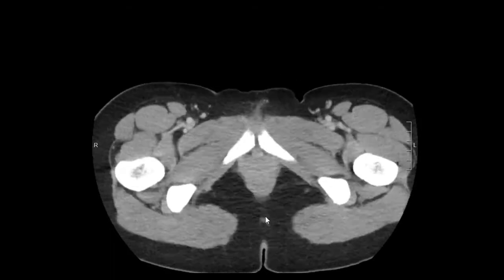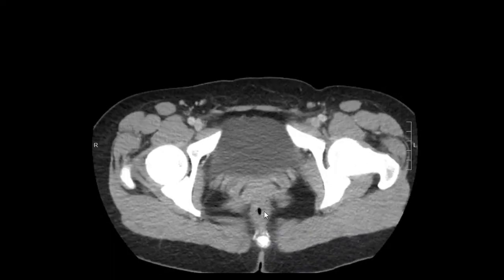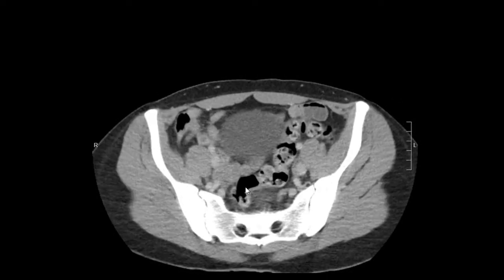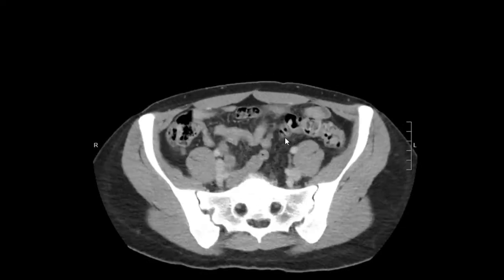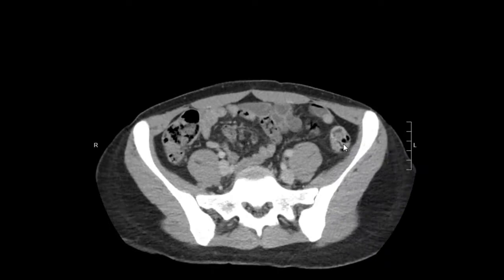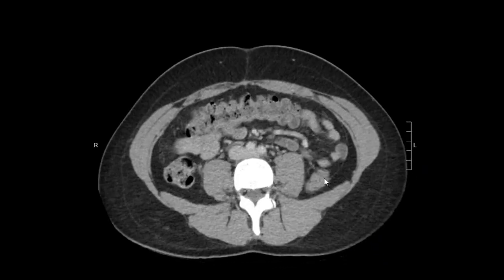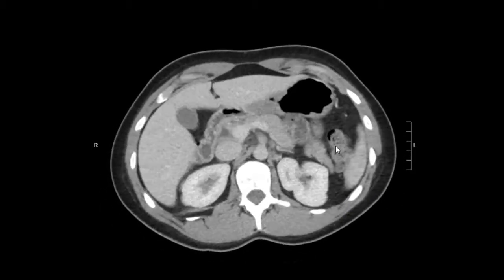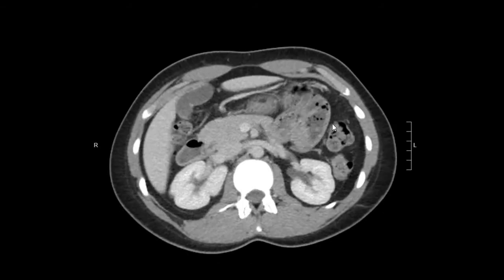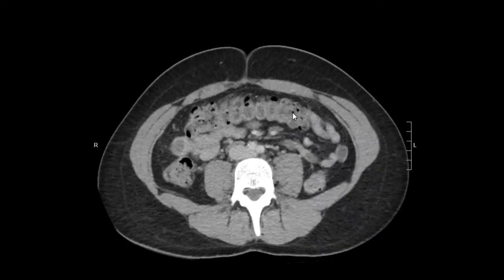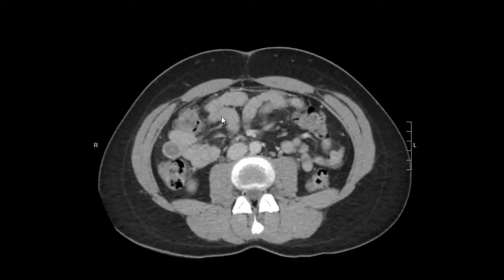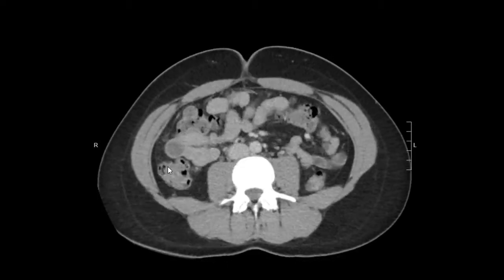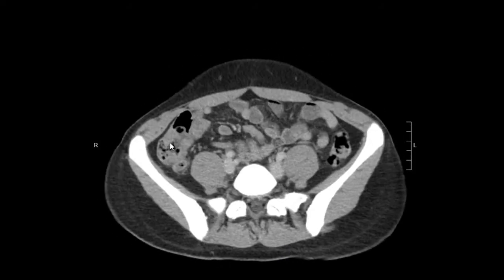Then we're going to evaluate the large bowel. I like to start from the rectum and go proximally. So here we have the rectum, the sigmoid colon with some stool, no diverticular disease. We're going to follow the large bowel superiorly — this is the descending colon into the transverse colon. Here we have the splenic flexure, and we're in the transverse colon now. No kind of abnormal bowel wall thickening or bowel wall mass. And ascending colon and cecum.